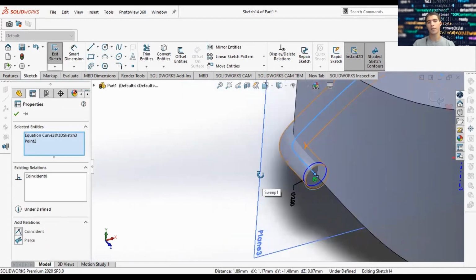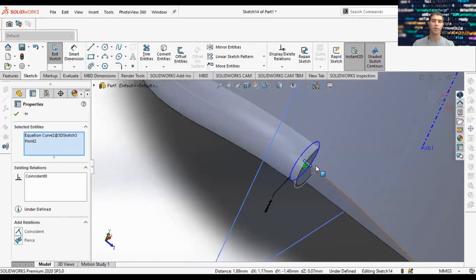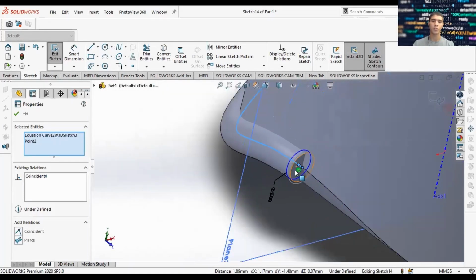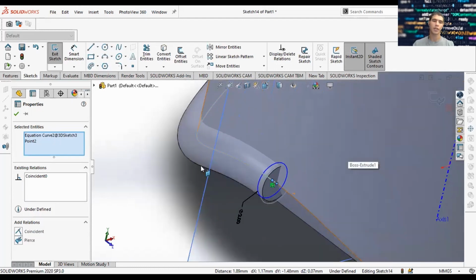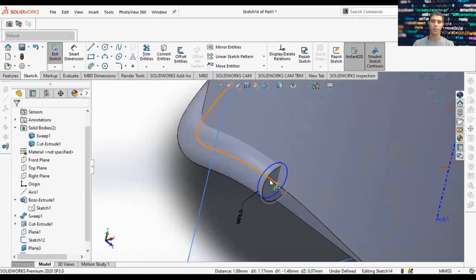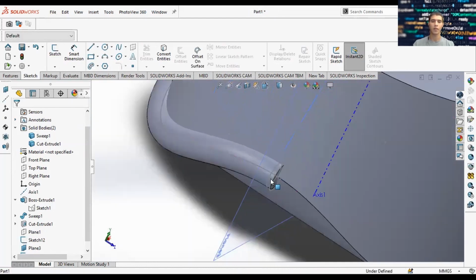There we go. So we're drawing on the plane that's at an angle, and we set a coincident. So I guess before we were just drawing on plane number 2 and plane number 1, but it was really the front plane. But this one is at an angle, and you'll notice that because this is the angle, it makes it 1.5. 1.5 angle of a difference.